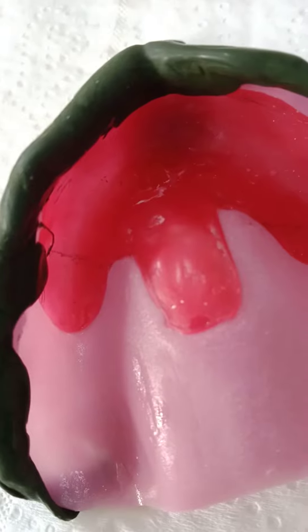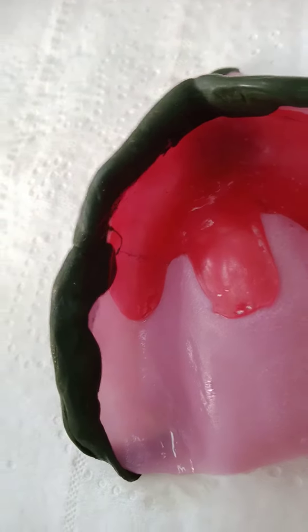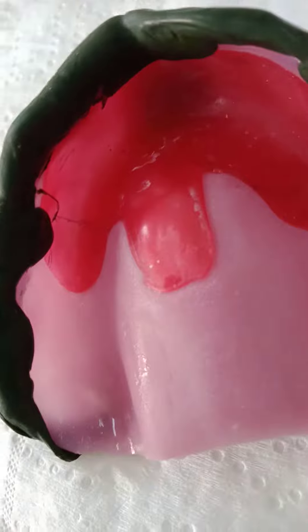Third: it's going to interfere and go into undercuts and cause pain for the patient. Other than it being sharp, it could go into an undercut. So remove it beforehand and try not to go over the wax.